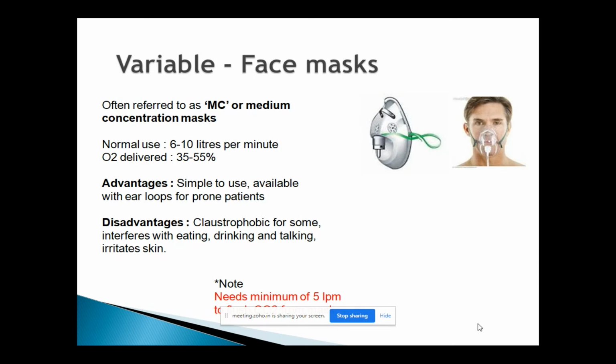Something important to stress here: if you choose to give somebody a face mask, it's important you give a flow of not less than 5 liters. The reason is that if the flow is not more than 5 liters, there is a high risk that patients can breathe in what they are breathing out.